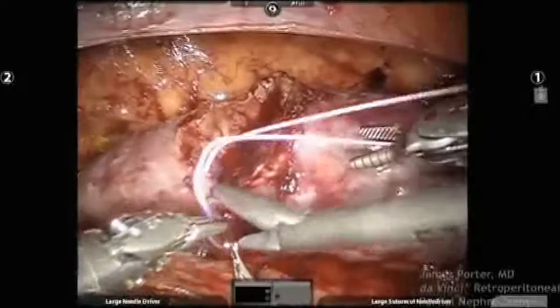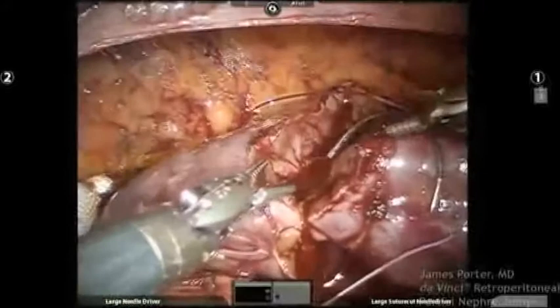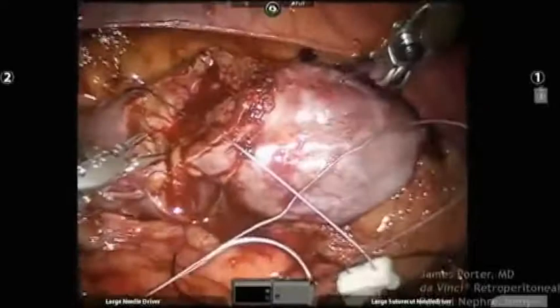I don't know, Eric. For me, I just think that you have to ligate those deep vessels somehow, whether it's individual ligation like he did or just a baseball stitch. I haven't seen this combination of what he's doing before. It's a nice closure, but back to the pseudoaneurysm comment, I know that Inderbir Gill's very first series, the comment was the needles going into the parenchyma causing pseudoaneurysms. I don't think we really know why.